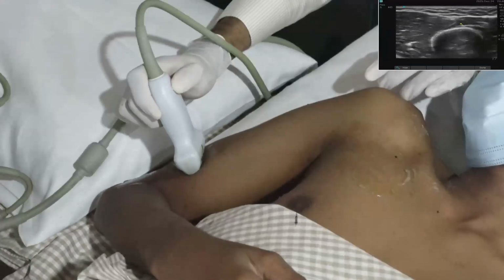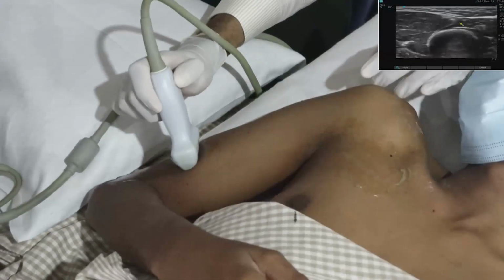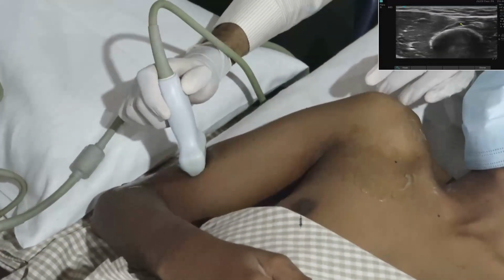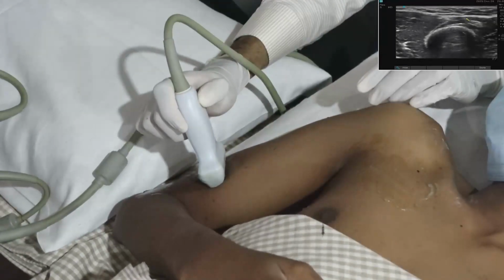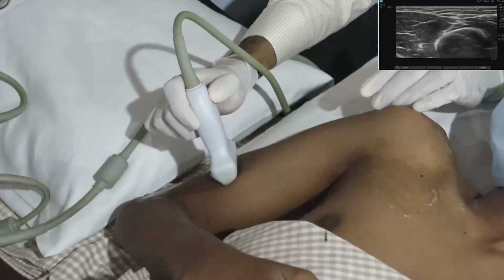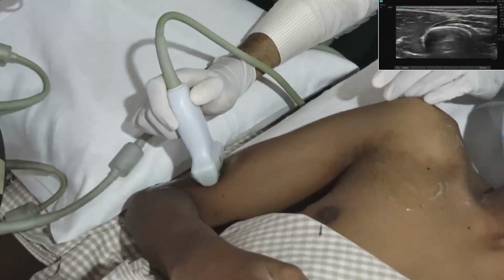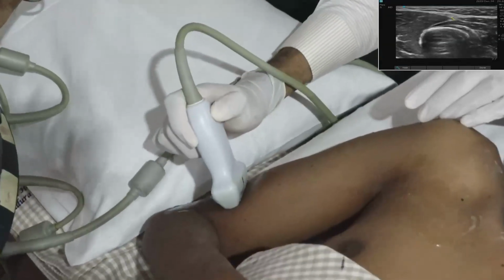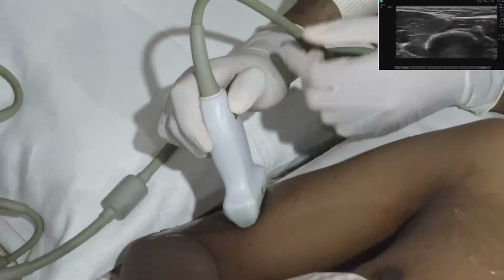One is the radial nerve main branch and the other is the posterior cutaneous nerve. So here we can see the dividing of this main radial nerve, and something is going near the subcutaneous area, that is the posterior cutaneous nerve of forearm.